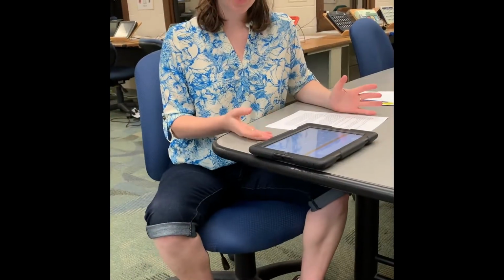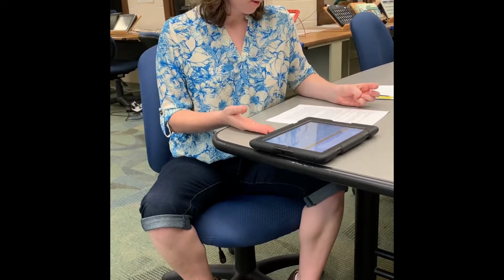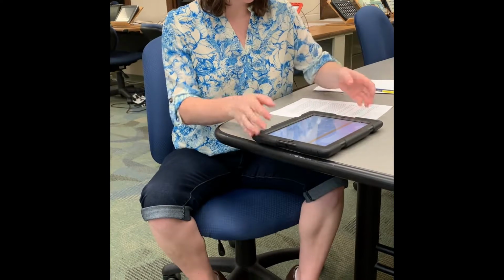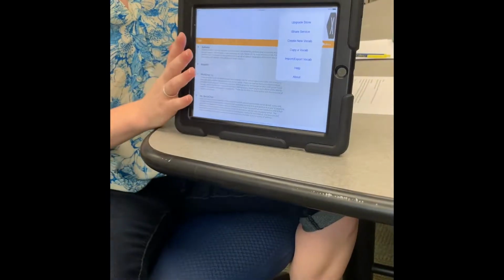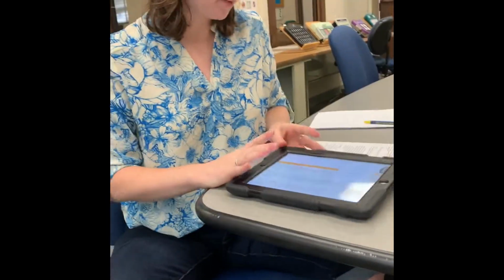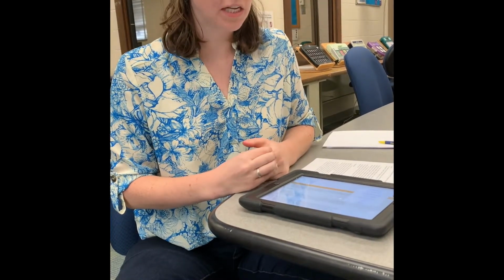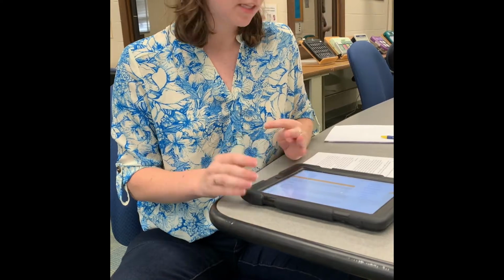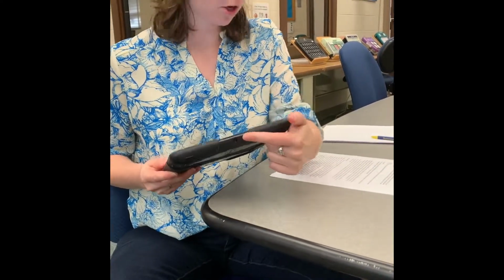In order to make specific changes to vocabulary files, TouchChat uses a supplemental program called Chat Editor. While buttons and vocabulary can be edited on the device itself by tapping Menu, and then create a new vocabulary set, and you can edit within different vocabulary sets, Chat Editor allows the family or professionals to customize the vocabulary options even while the device is not present. Vocabulary can be modified on a computer and then downloaded to the iPad with the assistance of a USB cable plugged into the charging port.